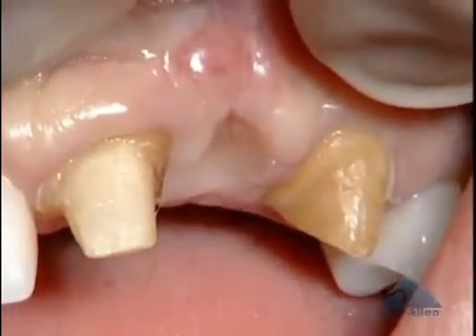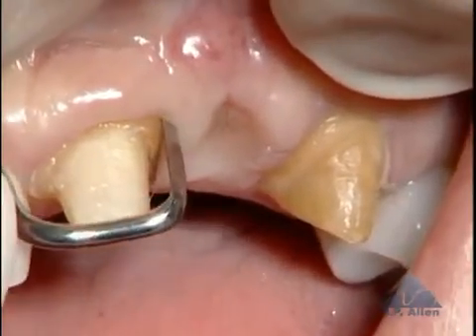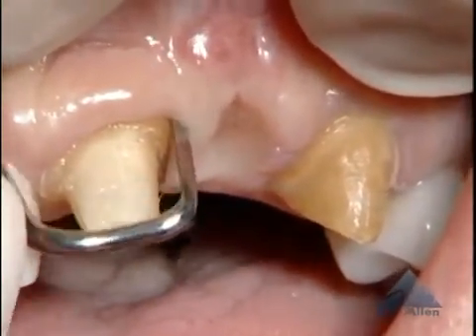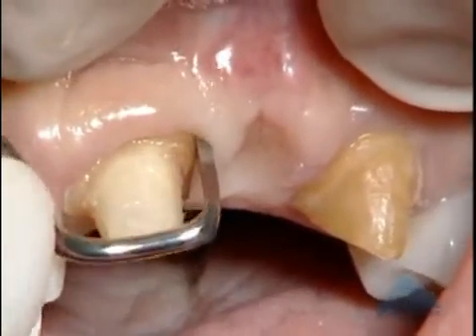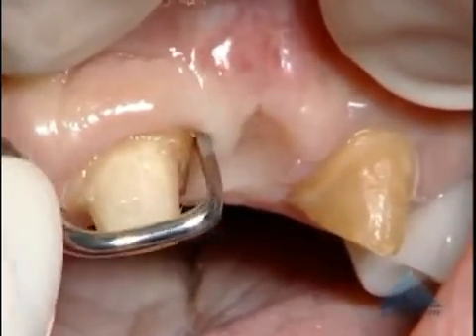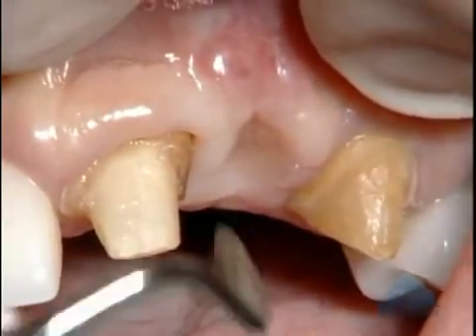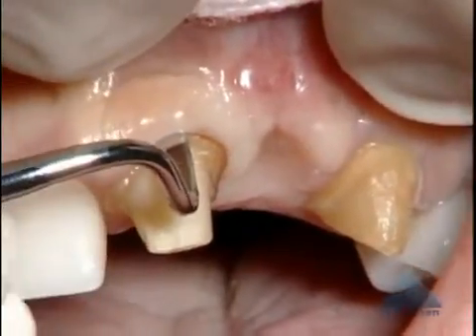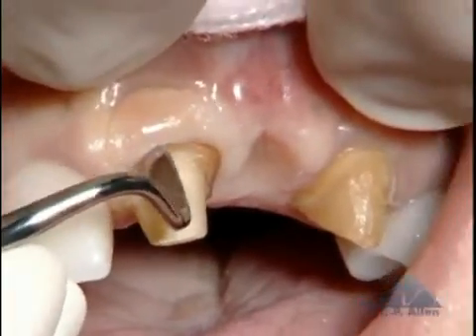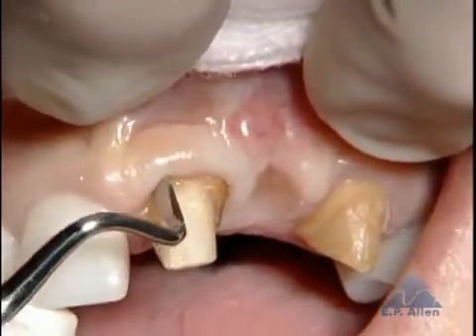I'll be using an Orban instrument to place these incisions and actually enter the sulcus area, and you can see there's a considerable distance to the crest. We make this incision to the alveolar crest, and that's due to loss of crestal height on the distal aspect of the central incisor, and that accounts for some of the recession that you see there.